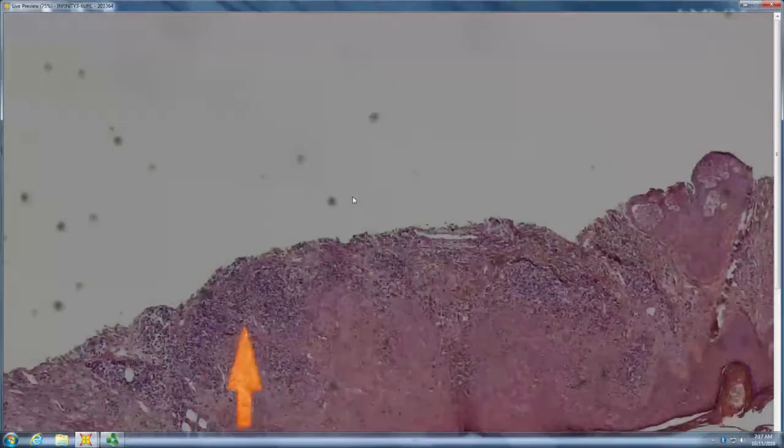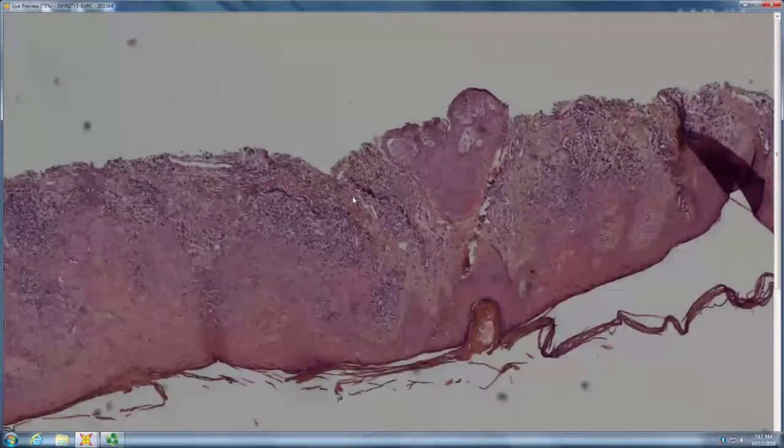And then there's a lot of lichenoid change. This is a patient with Hailey-Hailey who had a lichenoid drug eruption and ended up looking like your basic TEN patient in a burn unit, because their skin barely holds together under the best of circumstances, and then you add an insult and they have trouble.